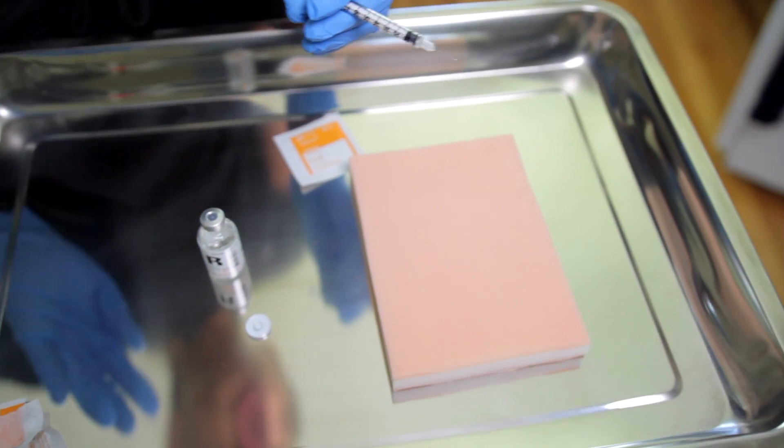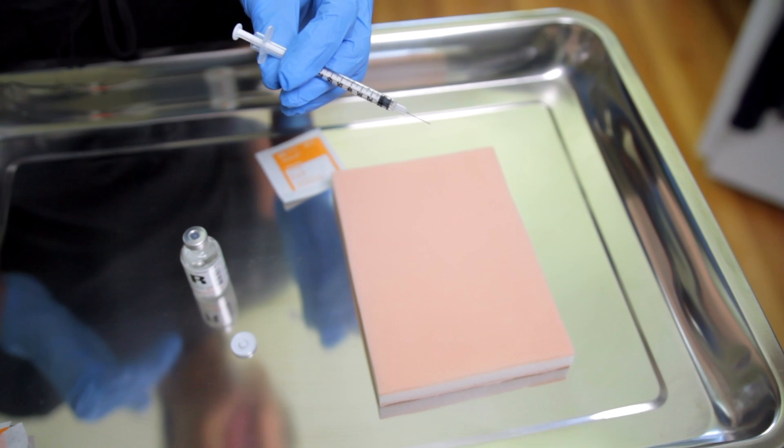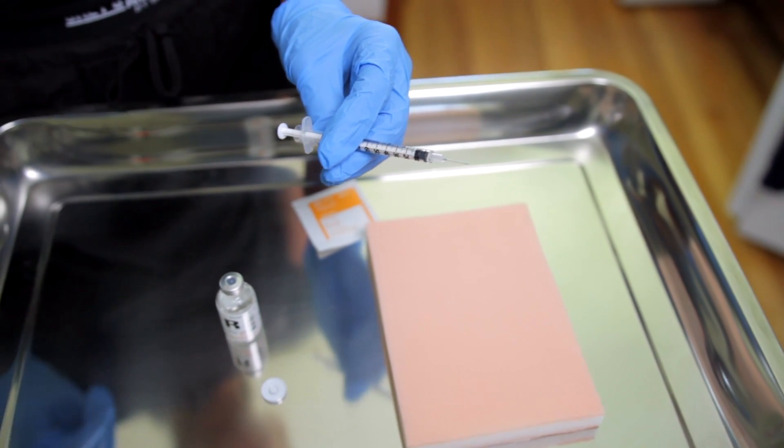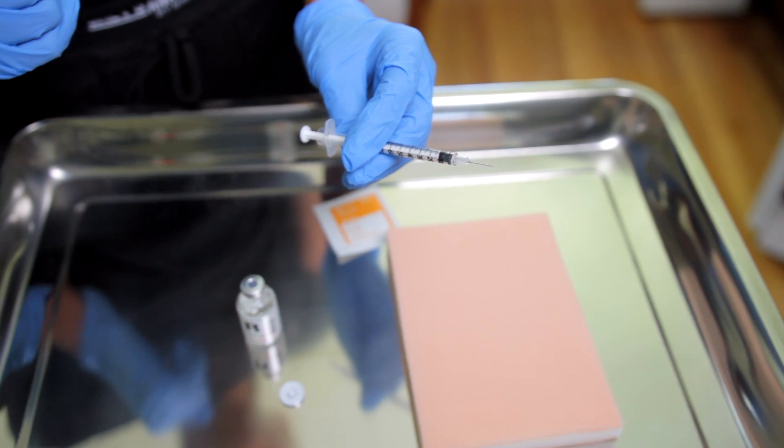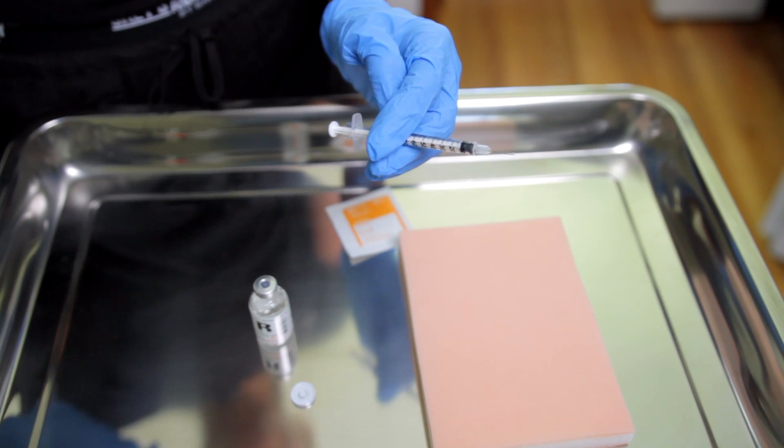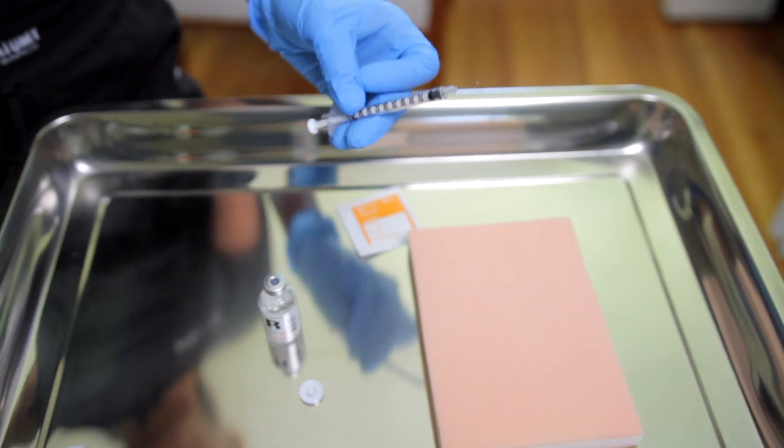I will prepare the skin. You can do the tummy as a site or the back of the arms, depending on the patient preference. And if they may have surgical wounds on their tummy, then I really refer to their arms as my primary choice. And you are all set.